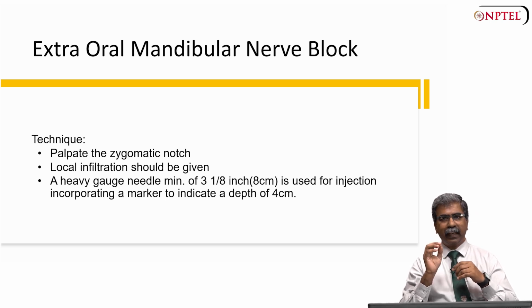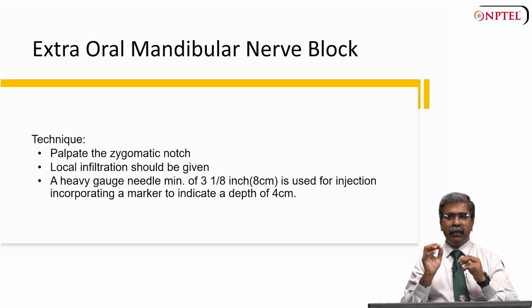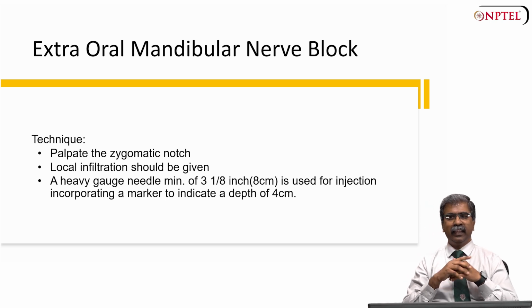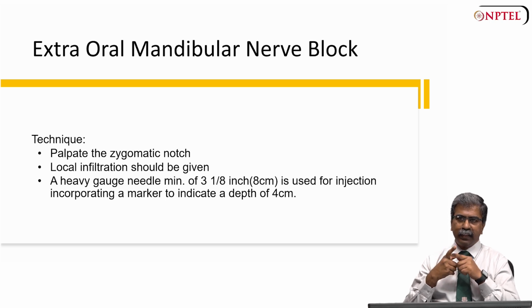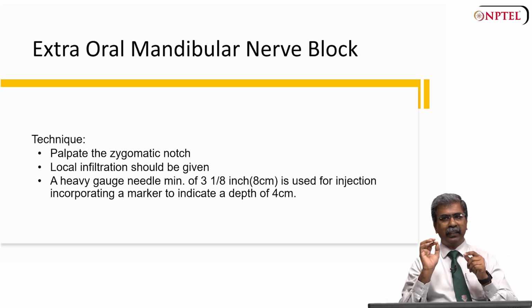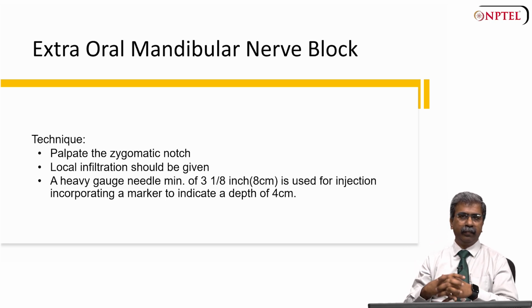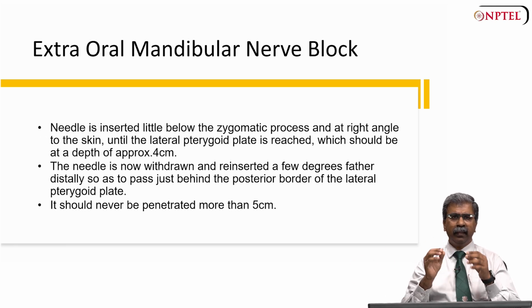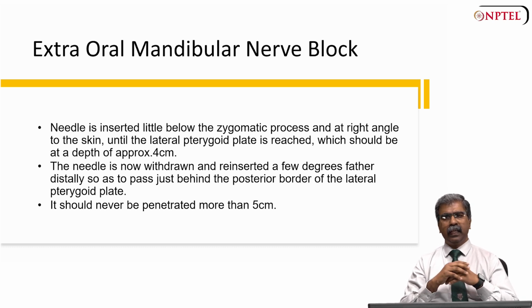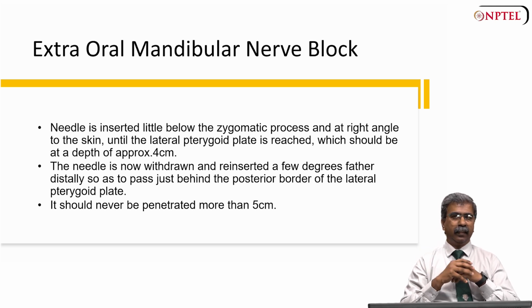A heavy gauge needle with a minimum length of 8 centimeters is essential, and that needle is also marked to indicate a depth of 4 centimeters, to ensure precise positioning for delivering the anesthesia to the targeted nerve. The needle is inserted a little below the zygomatic process at a right angle to the skin, continuing until reaching the lateral pterygoid plate at a depth of approximately 4 centimeters.